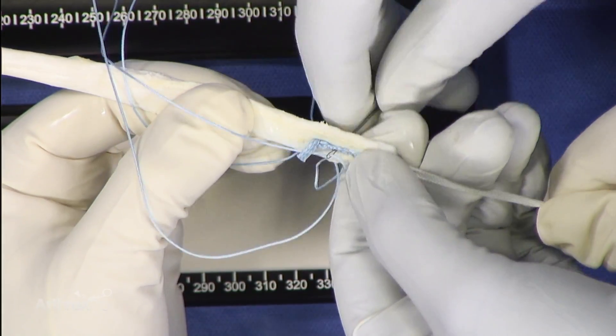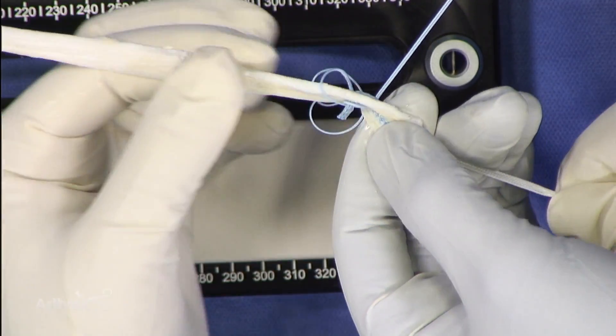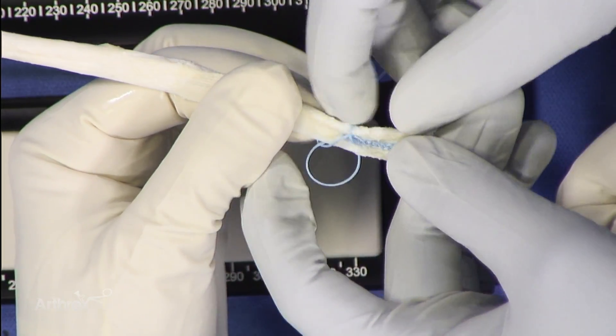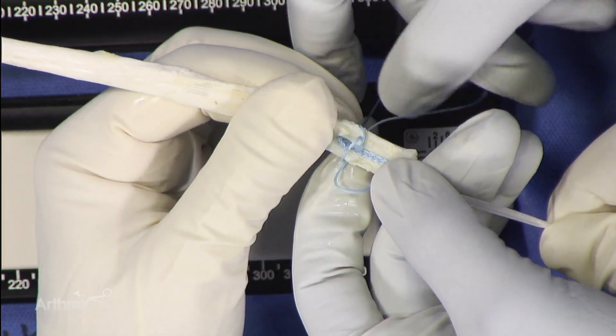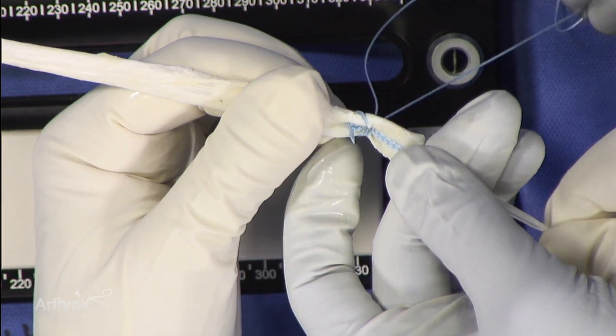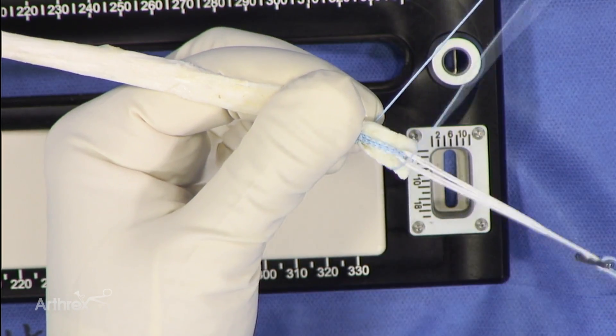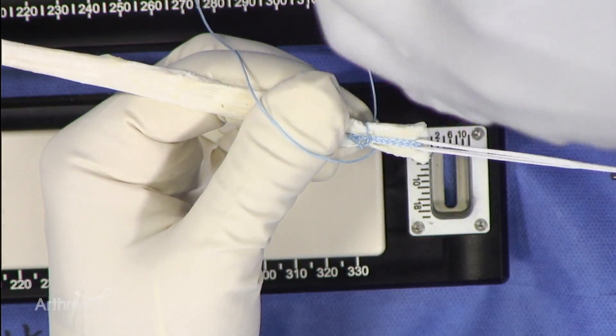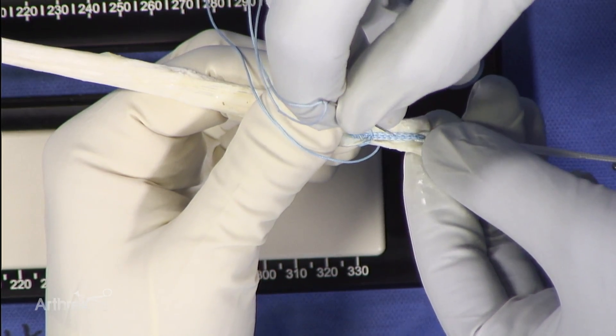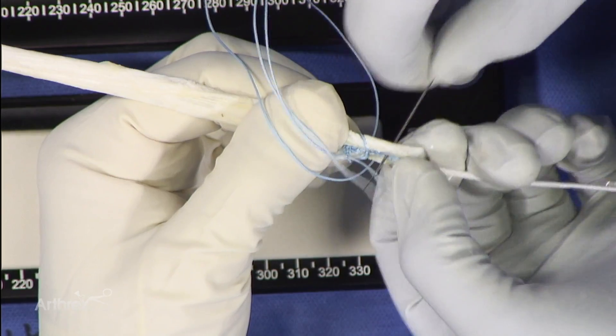And now we are ready to pass our fiber tag like a standard fiber loop technique. So we'll come through. Some of the grafts are a little bit taut, so you can do this with your hand or you can use a needle driver. And you come through.